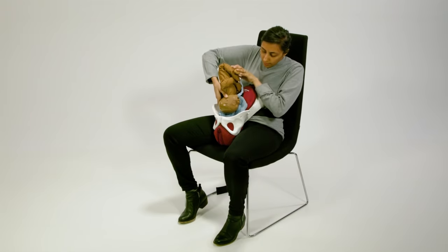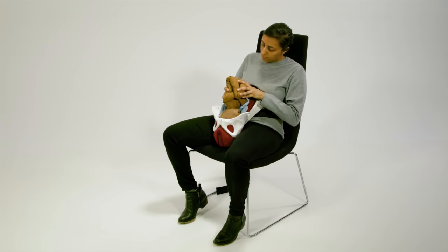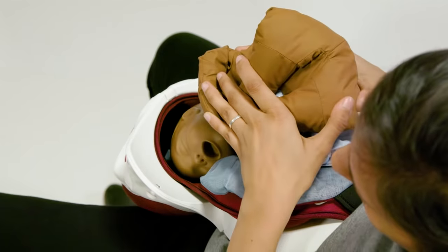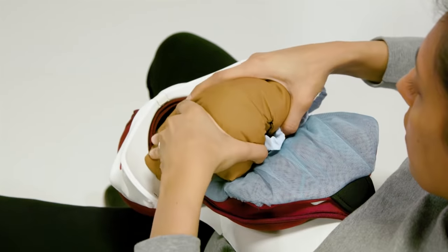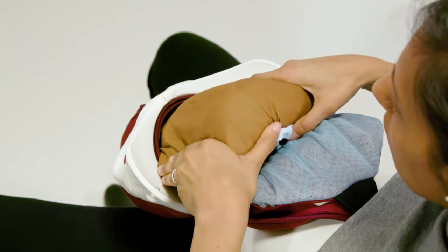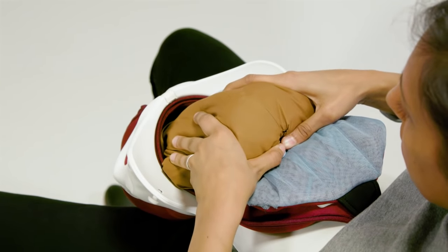To place baby Berthi in head presentation, lie the baby with the head in the pelvis and the buttocks at the fundus. During the simulation the facilitator manipulates baby Berthi with her hands. When the shoulders reach the pelvic inlet, control the movement to demonstrate that baby Berthi's head is not coming out despite the mother's effort to push.